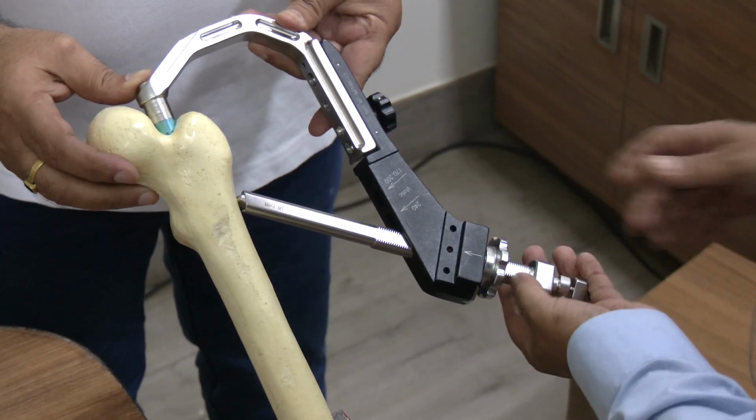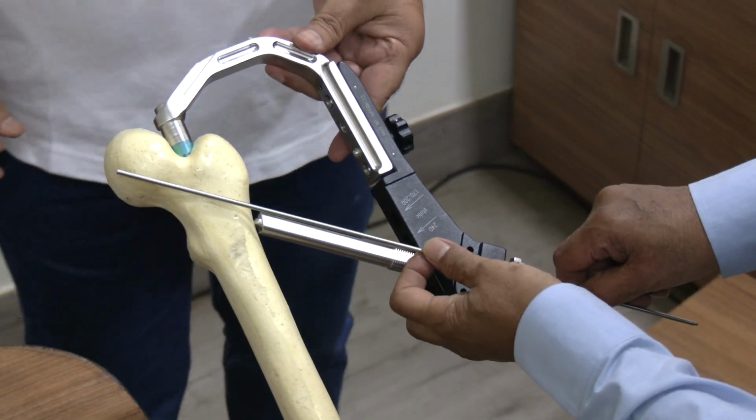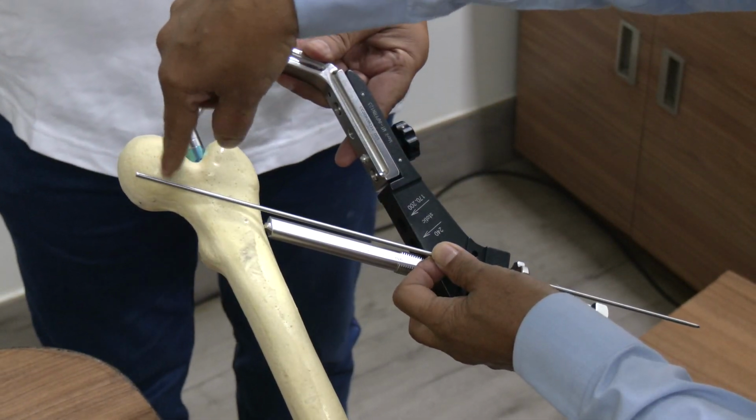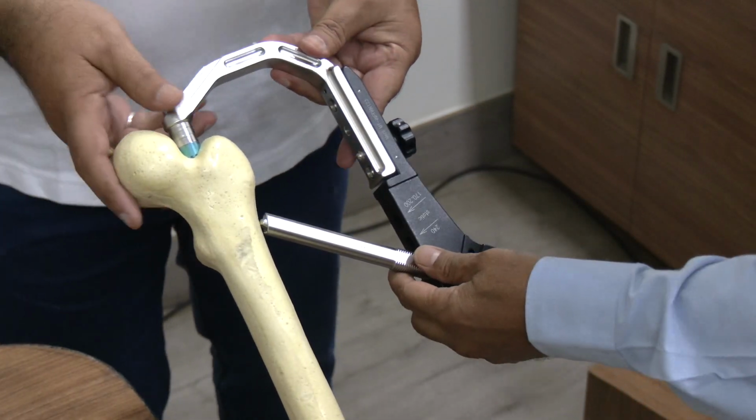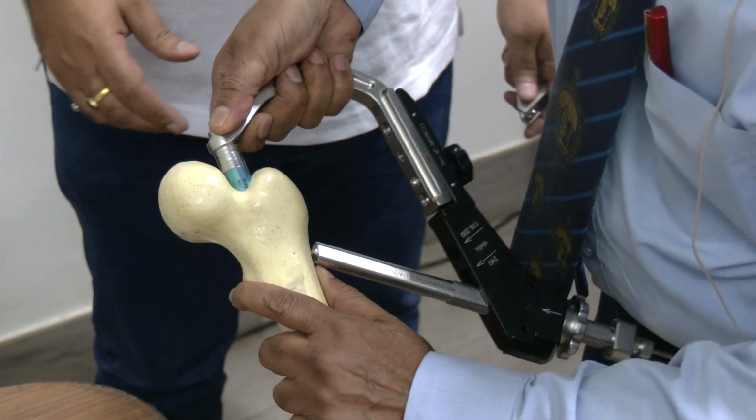Now you can see that I'll keep a guide wire over the body and see. If you see from the top, it is going too inferiorly. So I am withdrawing the nail a little and asking the assistant to hold it in that position.